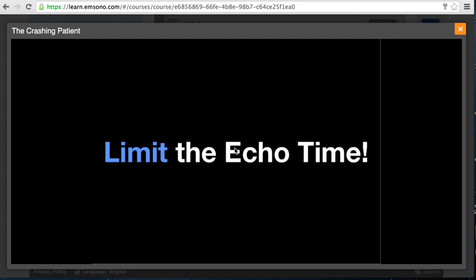I just want to take a second here to bring up the point that you really have to limit the time you take in performing the echo. If you look at all the new changes that have occurred in ACLS, it's now all about high quality CPR without breaks or very minimal breaks. You want to perform these focused echo exams when the breaks are being performed, over the 5 or so seconds that these breaks are being performed.